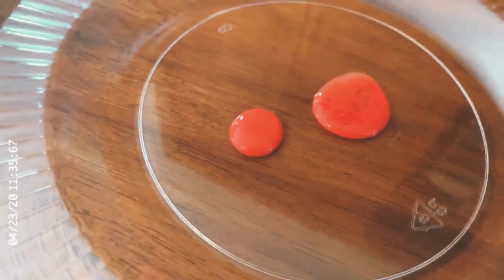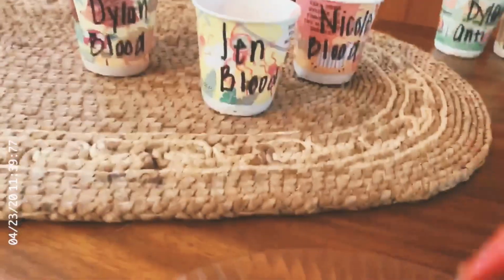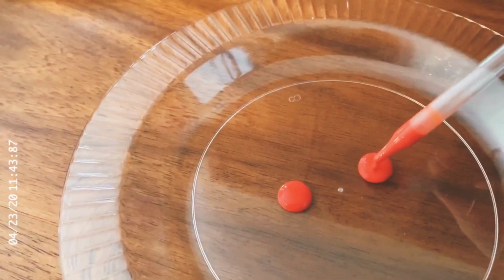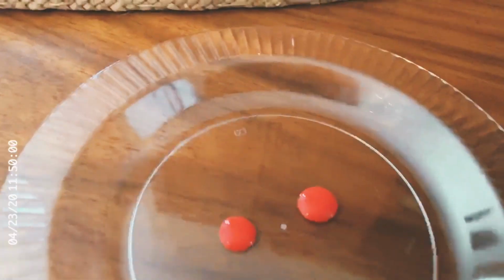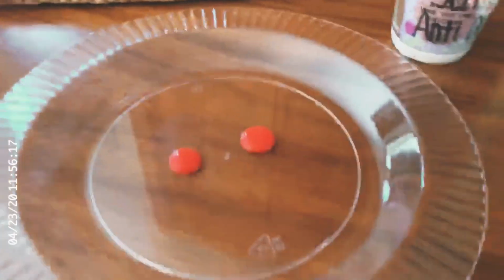All right, last one. Let's keep it going with Jen. I'm gonna get her samples of blood. Clean out our medicine dropper. I'm gonna go ahead and grab her anti-A and anti-B. I'm gonna do anti-A first. We're doing a nice procedure, following the same procedure every time.